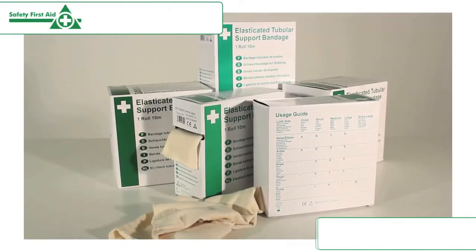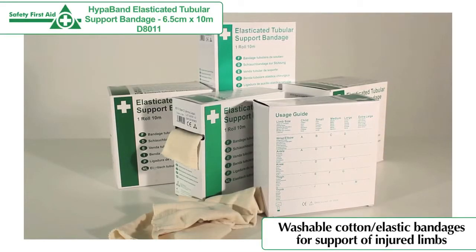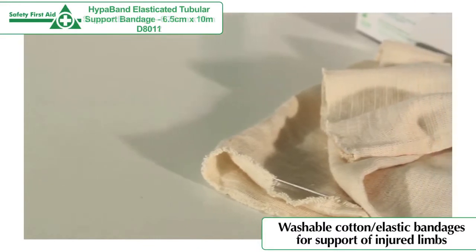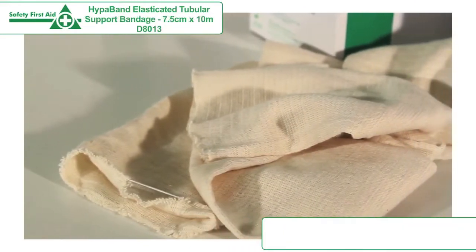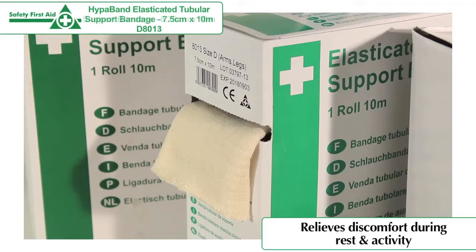The 10-meter white HypaBand elasticated tubular support bandages are washable cotton elastic bandages used for the support of injured limbs. These tubular support bandages help to relieve discomfort during rest and activity.